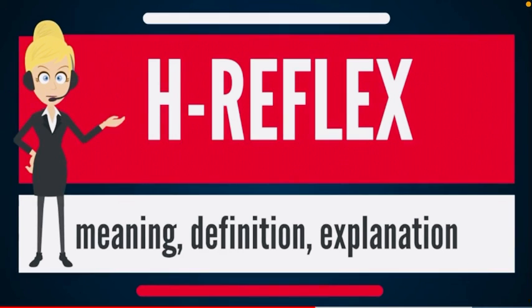Although the stretch reflex gives just qualitative information about muscle spindles and reflex arc activity, if the purpose of the test is to compare performances from different subjects, the H-reflex should be used. In that case, in fact, latencies (ms) and amplitudes (mV) of the H wave can be compared.